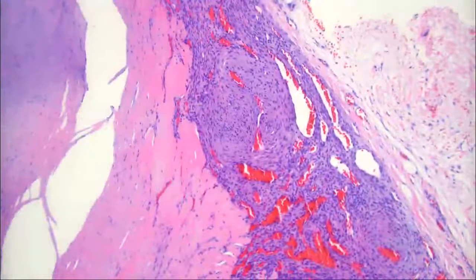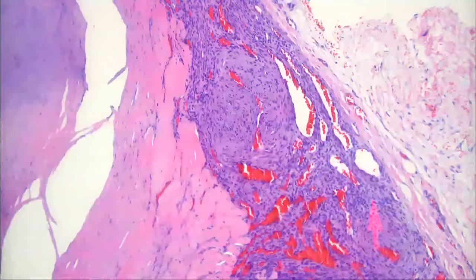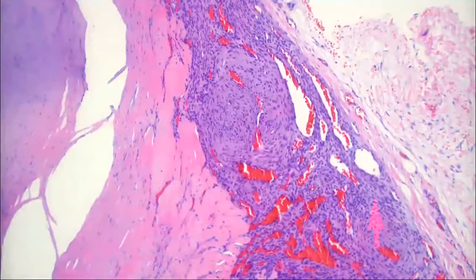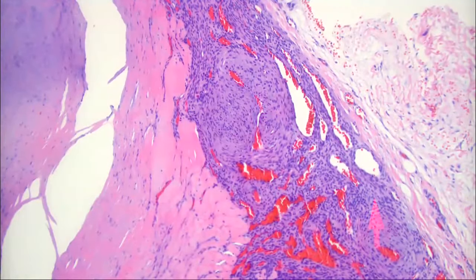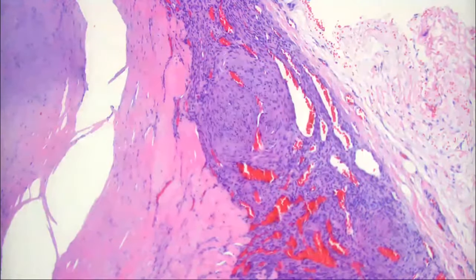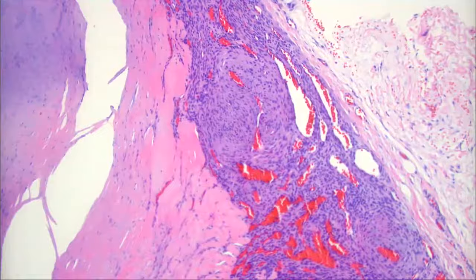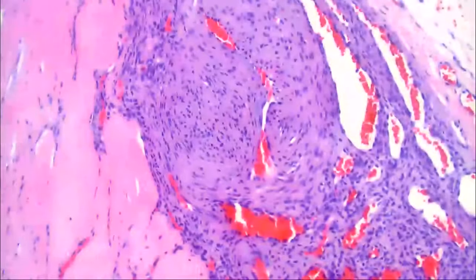There's a lot of red cells, a lot of vasculature there, and the cells look spindled in places. There is a spindle cell component. Good. Spindle cell, and it's got a purplish color to it, doesn't it? But what about this area? If you just looked at this area alone, what kind of differentiation are we dealing with here?